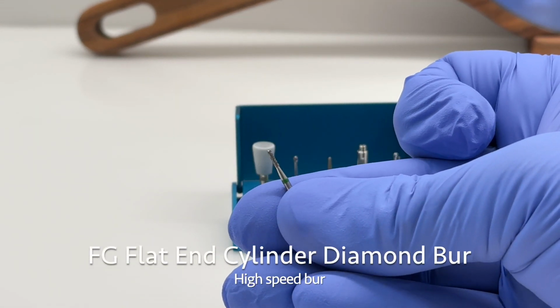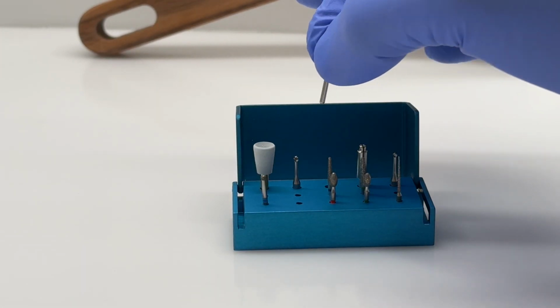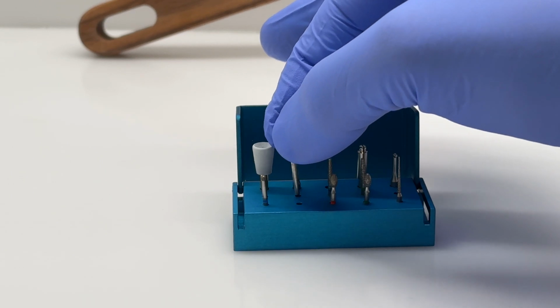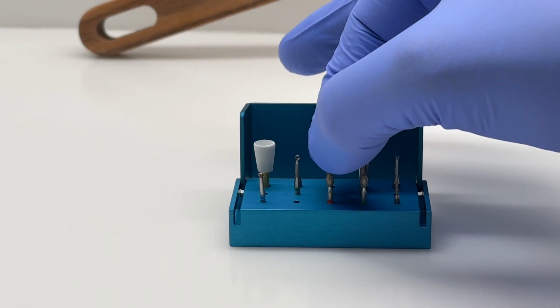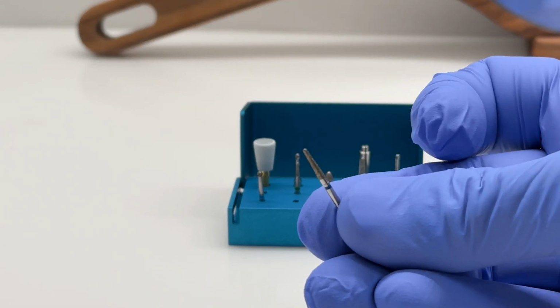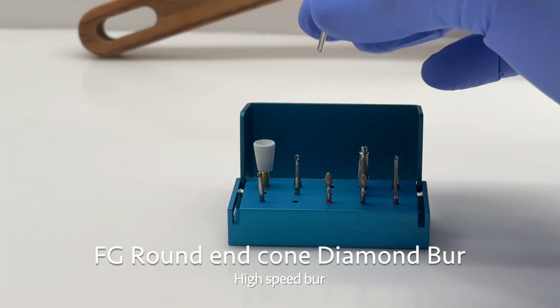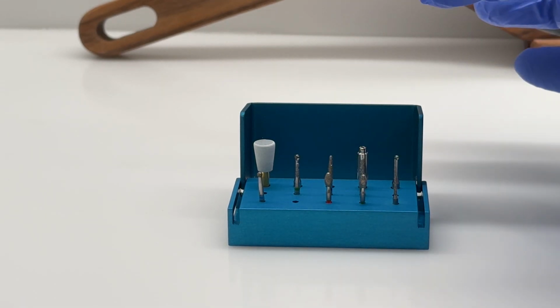Next up, we have our flat end cylinder diamond burr. This is very similar to your FG357 or your straight Fisher burr. Our office just likes to use the diamonds. As you can see here, we have the round end cone diamond burr, another high-speed burr.